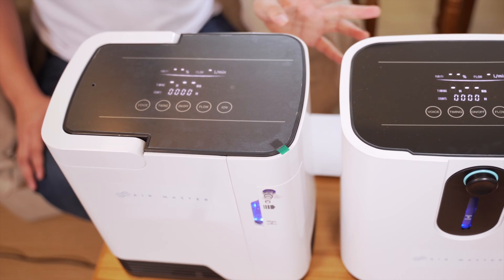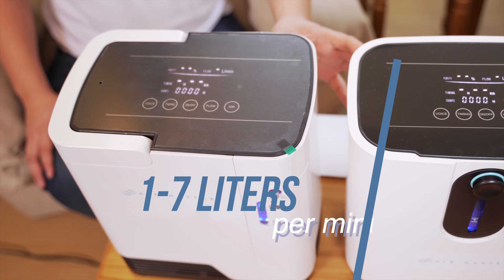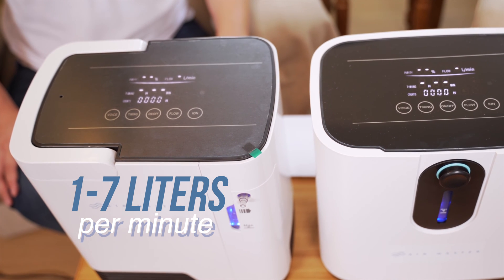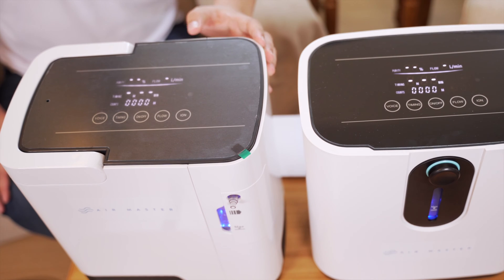These are two models, both 1 to 7 liters per minute. They have the same features and functions. The maximum it can give is around 7 liters per minute, and the only difference is basically the casing.